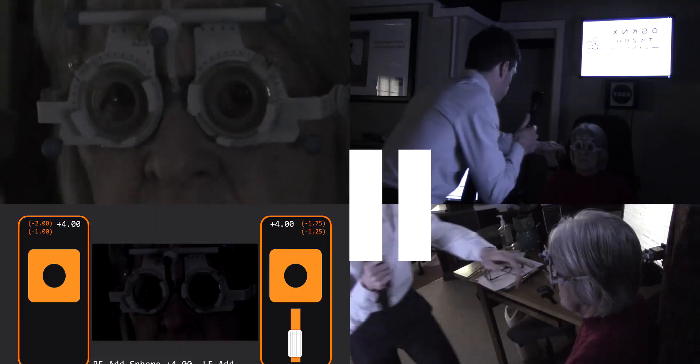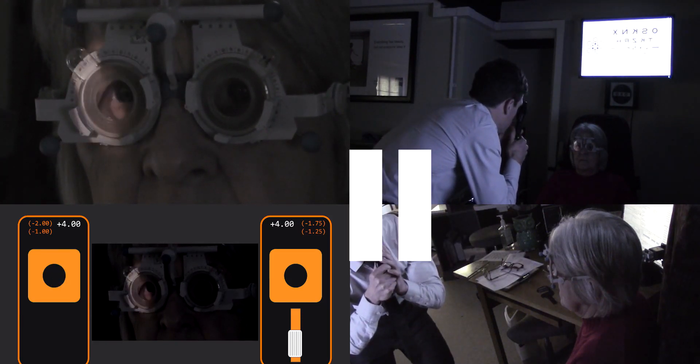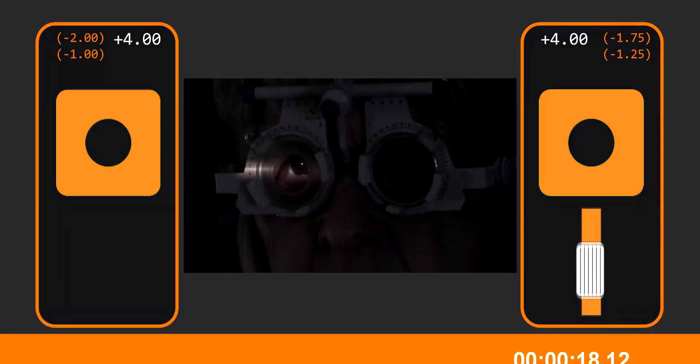The horizontal sweep shows a quick against movement and the vertical sweep a thinner against movement. A quick flash up and down with the horizontal sweep is inconclusive — the ret reflex is moving so fast that he can't be sure if it's neutral or against. There's a good way to find out: by reversing the vergence of light coming out of the retinoscope by pushing the collar up to the top.